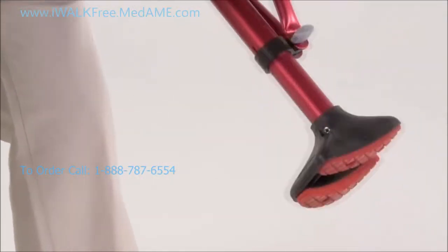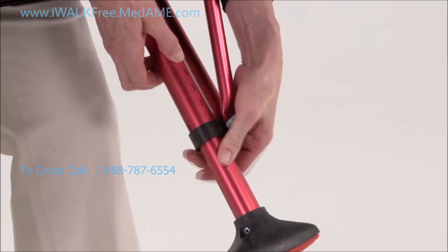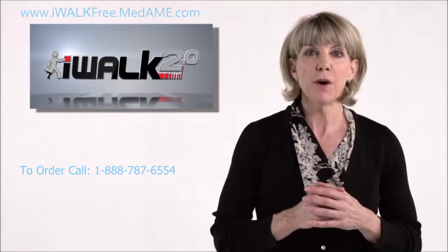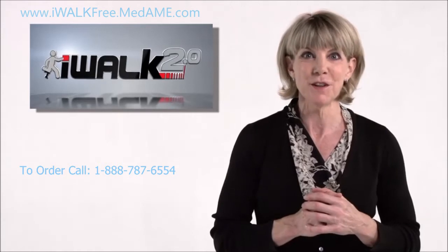You can raise or lower it by pressing in the push button springs and raise or lower the foot until you have the correct height. We've purposely set the height a little low because it's going to be easier for you to learn at this height.